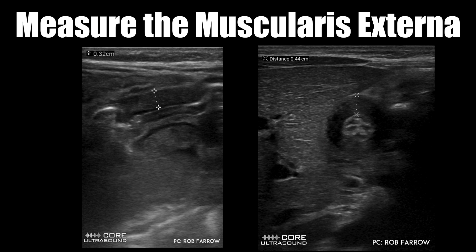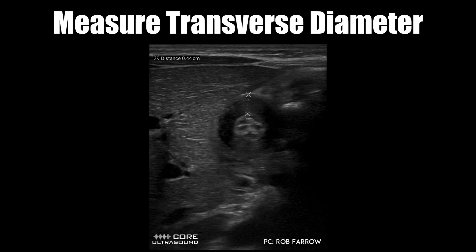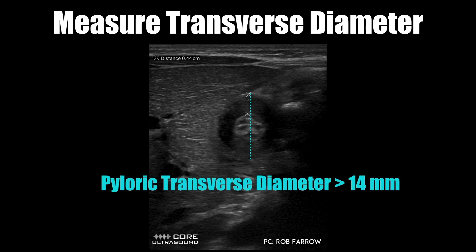The first thing you'll likely want to measure is the muscularis externa. This is the most accurate and most reproducible measurement when diagnosing pyloric stenosis, and you can measure this in the long and in the transverse axis. We have to remember our sonographic anatomy and make sure we're not including the serosa, the muscularis mucosa, or the submucosa in our measurement — we are focusing solely on the thickness of the muscularis externa. When you look at the transverse diameter, keep in mind we're looking at the entire diameter of the pylorus, shown here by the blue dotted line.